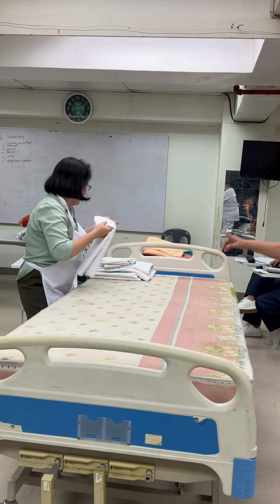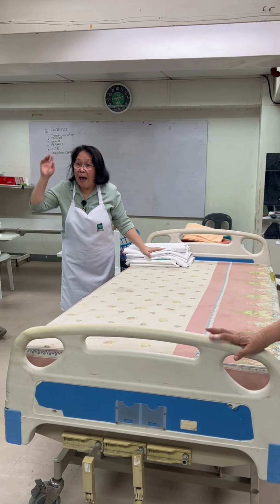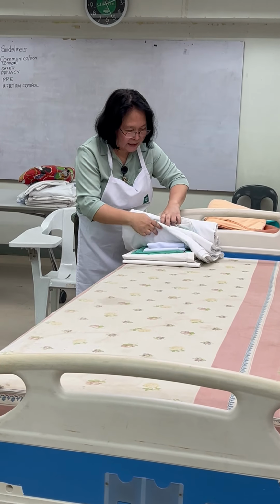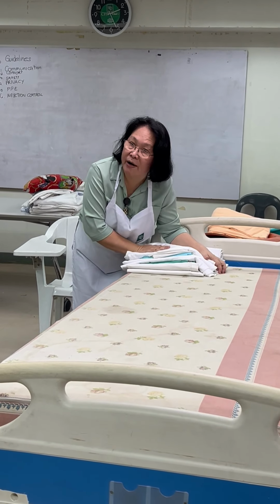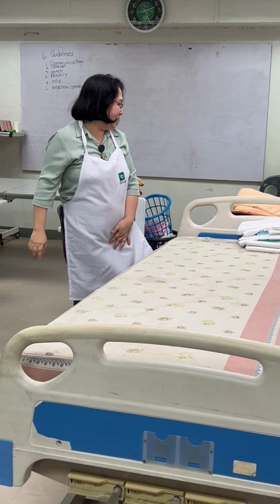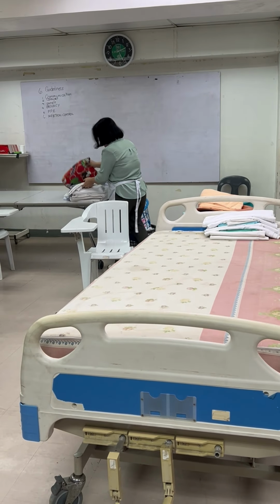Okay. So, we are already complete set for unoccupied. We have here the bottom sheet, rubber sheet, draw sheet, top sheet, incopad, pillowcase, cover. Okay. Now, we are going to prepare the occupied. So, bottom sheet.